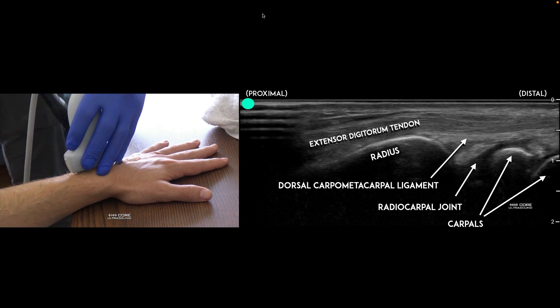You can see here the joint labeled — we have the extensor digitorum tendon as the top part of that joint, the roof. We can see the dorsal carpometacarpal ligament over top, and then right here is that radiocarpal joint, or wrist joint, where we're going to identify fluid.